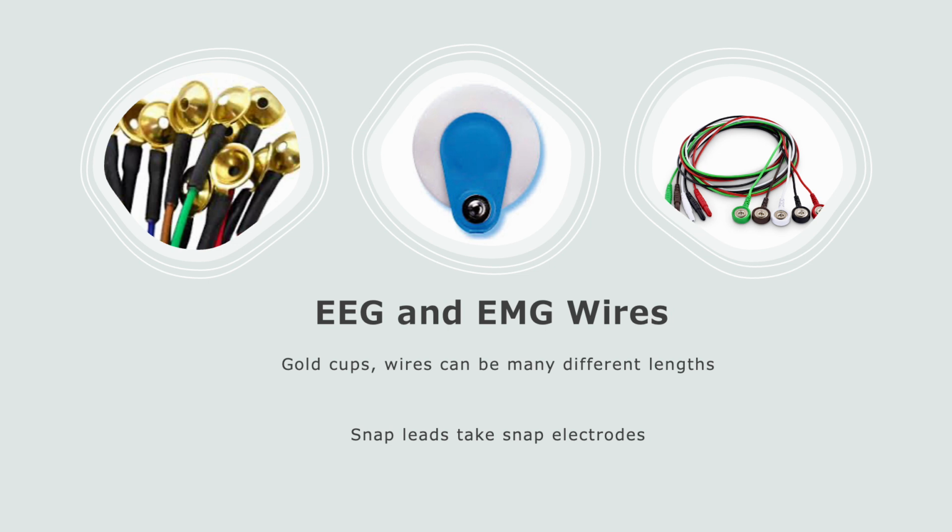On the legs, though, those snap wires can be thicker and heavier, and the gold cups can last longer. When patients get out of bed, they can stand on a leg wire, and if they don't rip the tape off, they'll snap the wire in half. These wires can be tough, but they will break, and they'll stretch too, making it look like the wire's fine, but on the inside, the metal is actually severed.